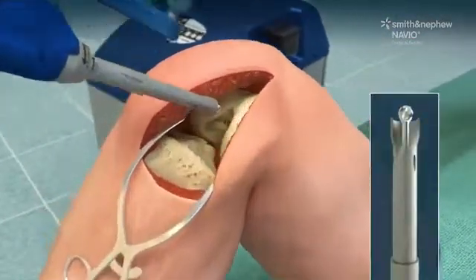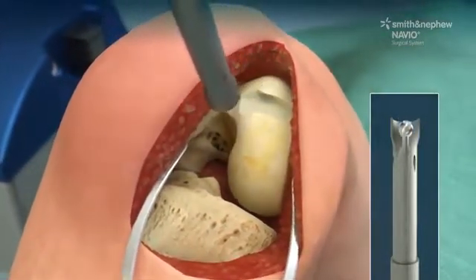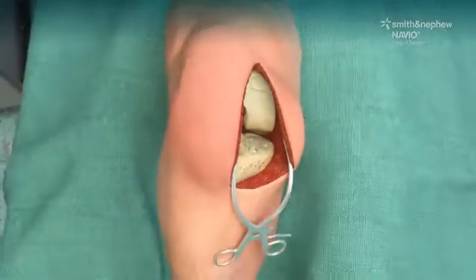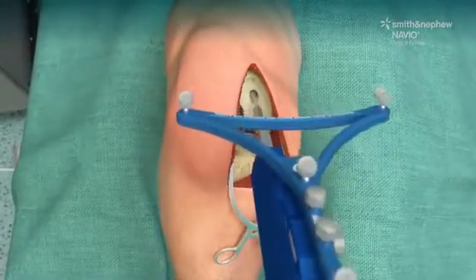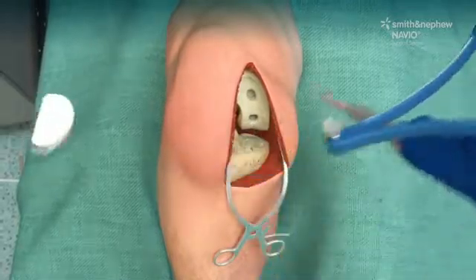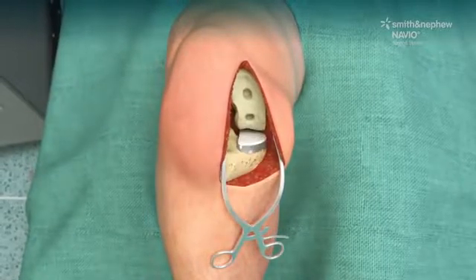The surgeon accurately removes the damaged bone surface using robotics assistance, making room for the implant. The final step confirms the implant is placed accurately, as intended, based on the surgical plan.